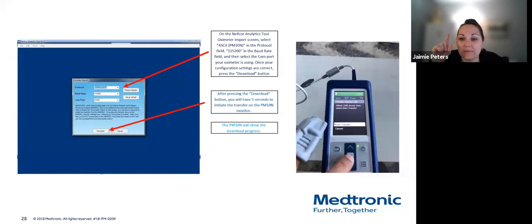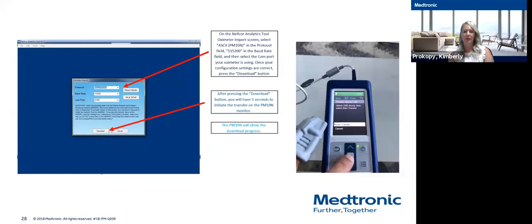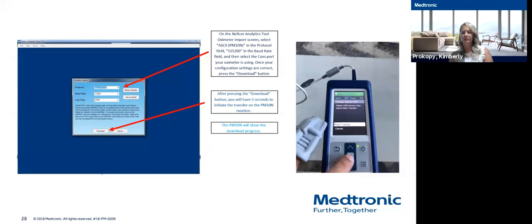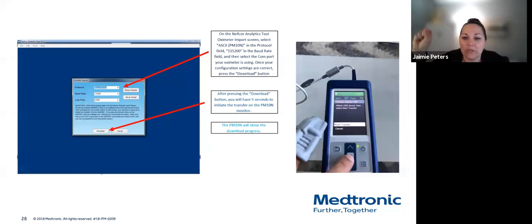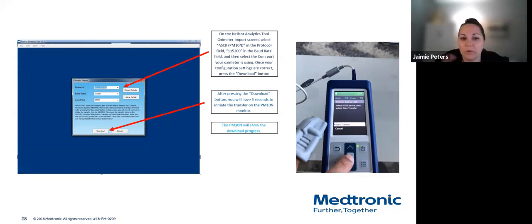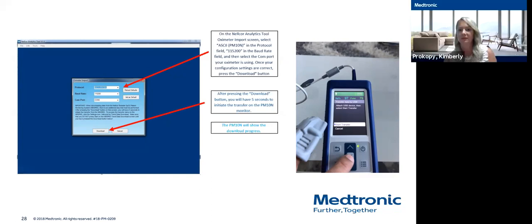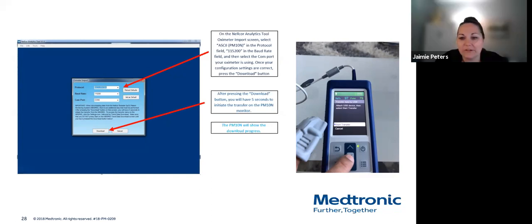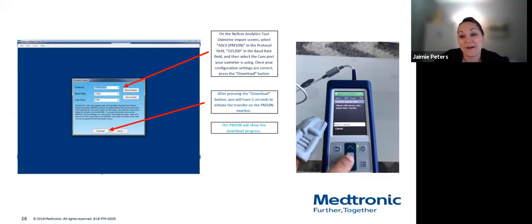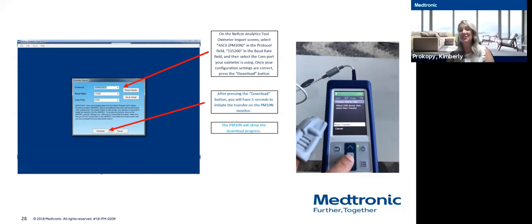The other thing is, and you shouldn't be altering your data at all, but you do have to alter the data that comes out of the Excel file because there's so much extra stuff on there. You can make edits there and then do your charting of what was happening during the test right in the Excel file as well. If you see that video, you'll know a little more what I mean, but the spot check is really helpful. I wish it was automatic. I wish you could program the spot check. I've told Remy that for a few years. I'm like, you need to get on them and say, just get that every 5 seconds or something, which would be awesome.